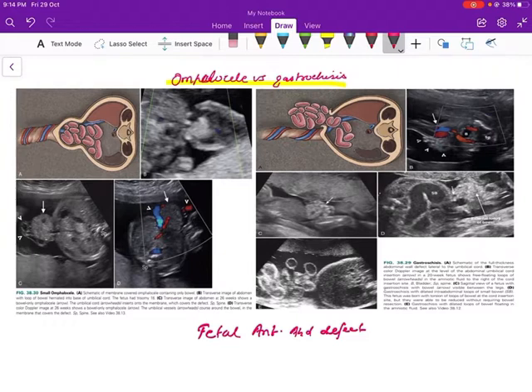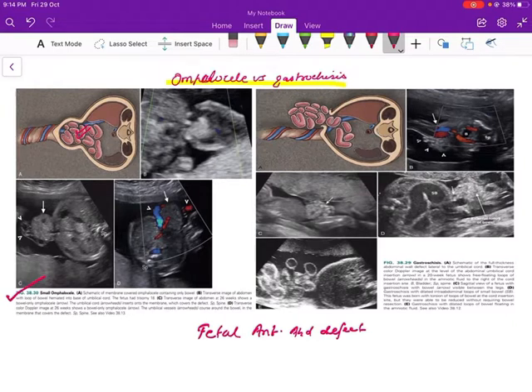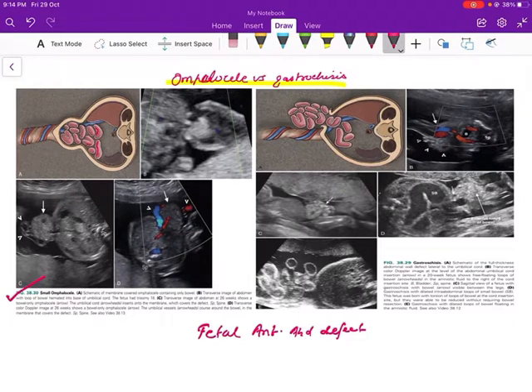First, we will see omphalocele. What happens in omphalocele is there is a midline defect in the fetal anterior abdominal wall at the level of the umbilical region. There is an anterior midline umbilical region defect through which intra-abdominal contents like small bowel loops are seen herniating. If the defect is larger, other viscera like liver and spleen can also herniate.